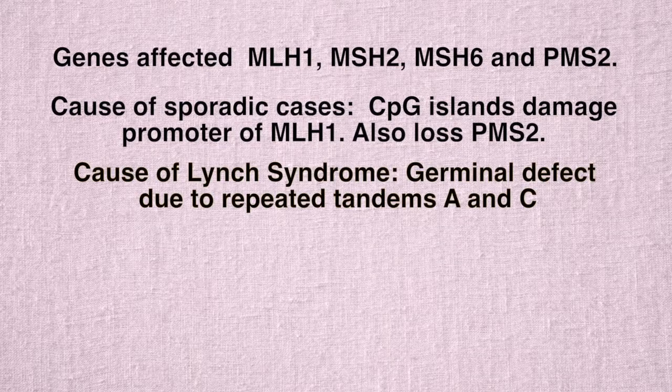MSI in the Lynch syndrome or hereditary non-polyposis colon cancer. Most cases in the syndrome are related to germinal defects in the MMR genes. The most common is MSH2, always associated with loss of the MSH6. The damage of the gene is related with presence of repeated tandem sequences of adenine and cytosine that are replacing normal nucleotides in the DNA.